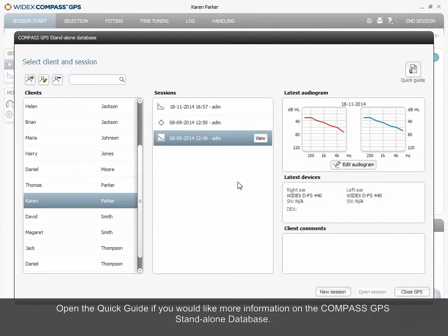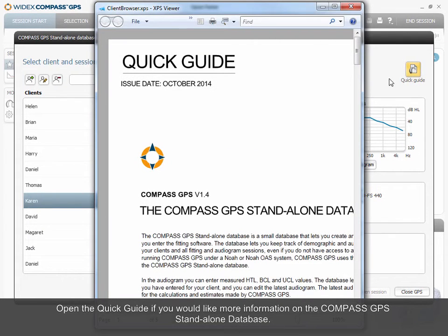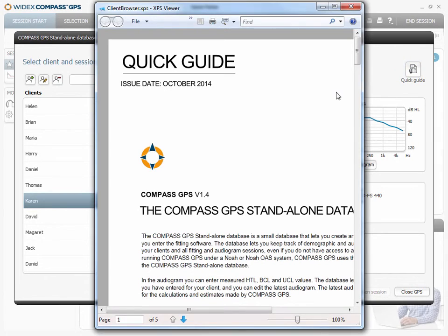Open the Quick Guide if you would like more information on the Compass GPS Standalone Database.